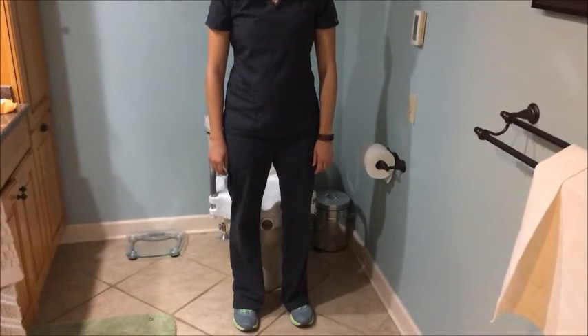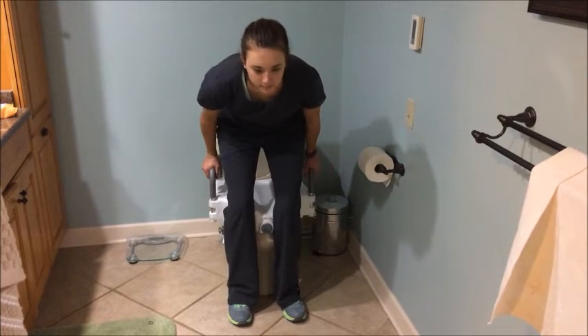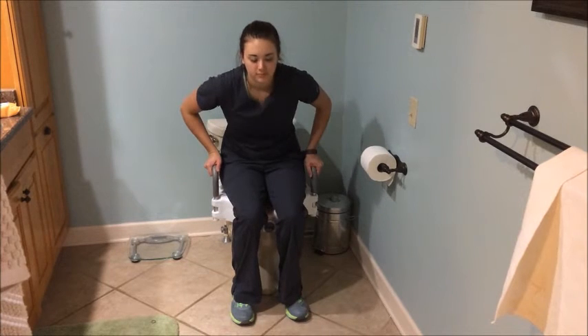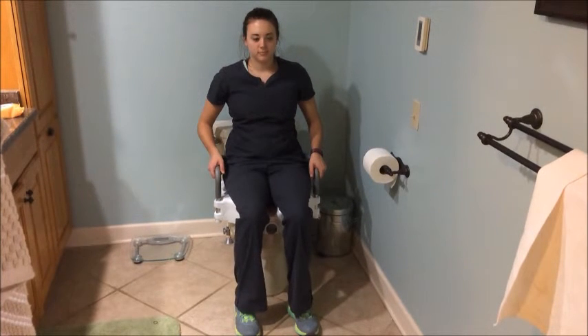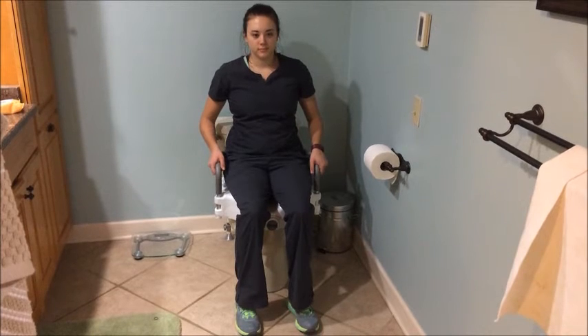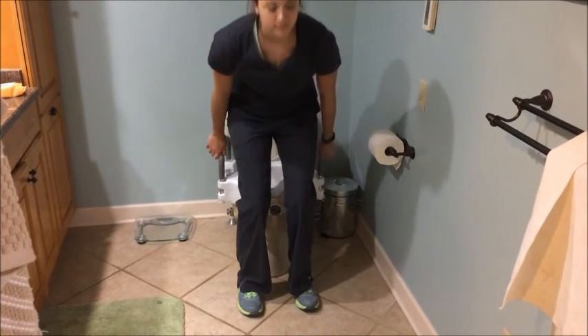To use the raised toilet seat, step back until you feel the seat at the back of your legs. Reach back for the base of the seat or armrests and slowly lower yourself onto the seat. While seated, your feet should touch the ground. Place your arms on the armrests or base of the seat and slowly raise yourself to stand.